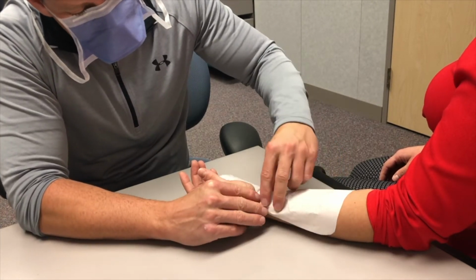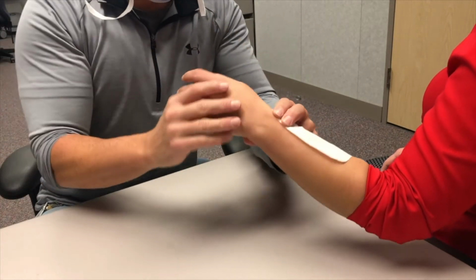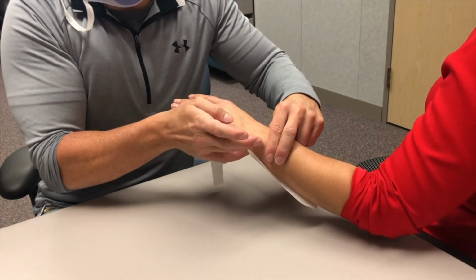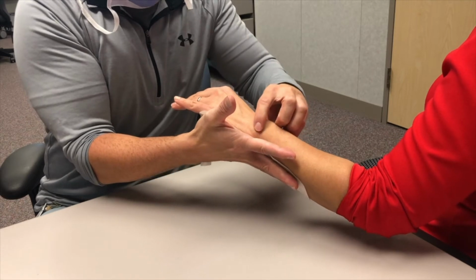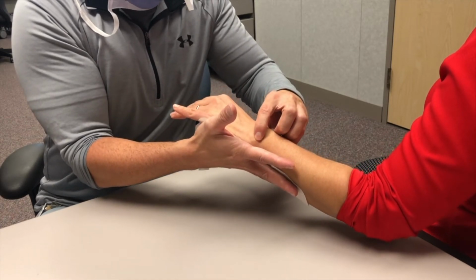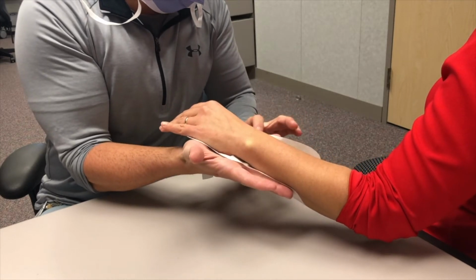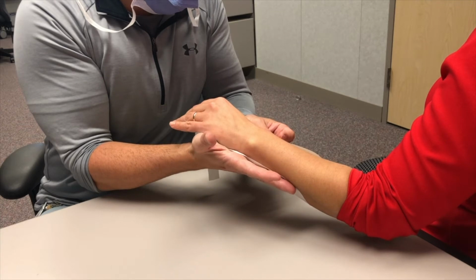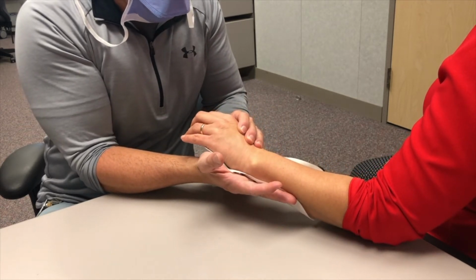We want to make sure it clears the radial styloid well, and that it does not impede the ulnar head, and that it is long enough so it doesn't cause any squeezing or impingement of that while you're wearing it, because this tends to be a site of irritation for our clients in wrist cock-up splints. So this pattern looks satisfactory. Right now we're going to move on.